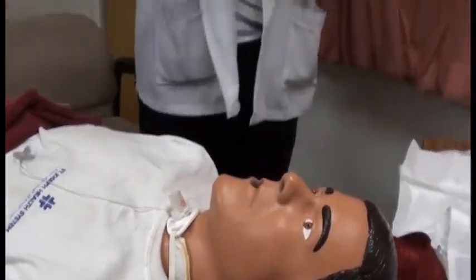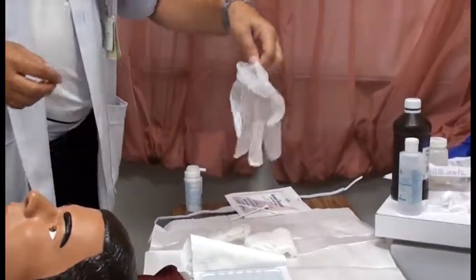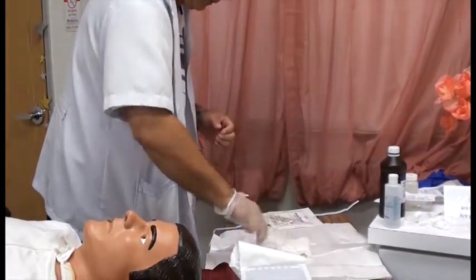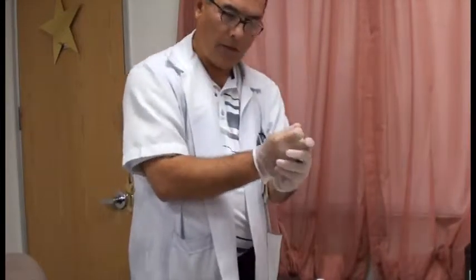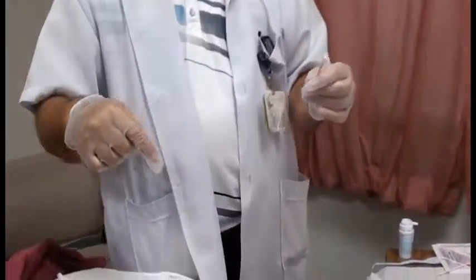Okay. Now I'm going to be changing my gloves at this point. Clean my hand. So now I'm going to be putting on my sterile gloves. Okay. So we got our sterile gloves on. So what I'm going to do now is I'm going to clean the tracheostomy site itself.